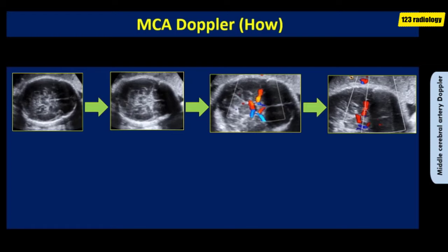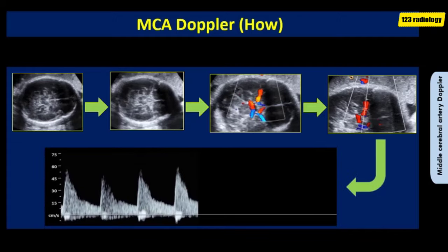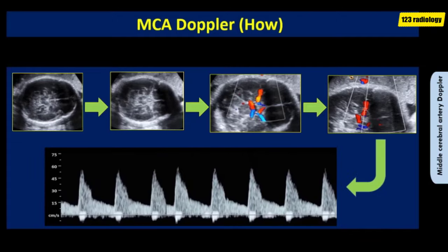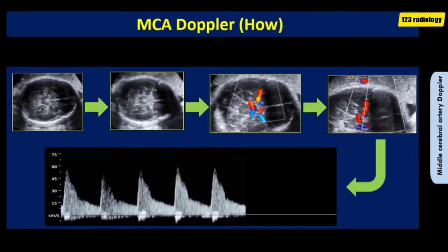To perform Doppler study of the middle cerebral artery, obtain a transverse view of the fetal brain at the level of the biparietal diameter, then move the transducer towards the base of the fetal skull. Activate color Doppler imaging — the circle of Willis is easily visualized, with the MCA seen as a short vessel running in an anterolateral direction. Assess the MCA closer to the transducer. Align the MCA flow direction with the Doppler beam and place a small sample volume 2 mm from the MCA origin. Optimize the spectral Doppler baseline and PRF to get a large waveform.